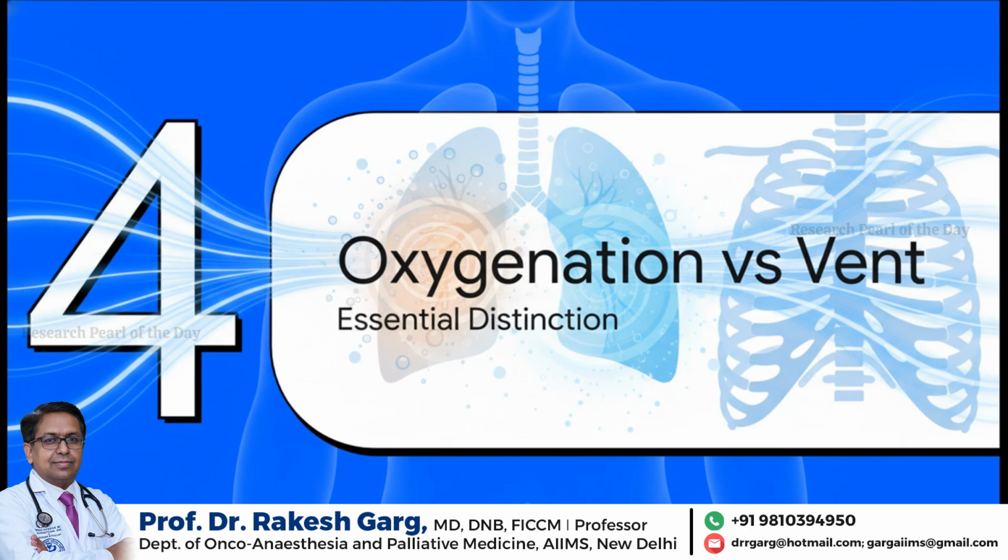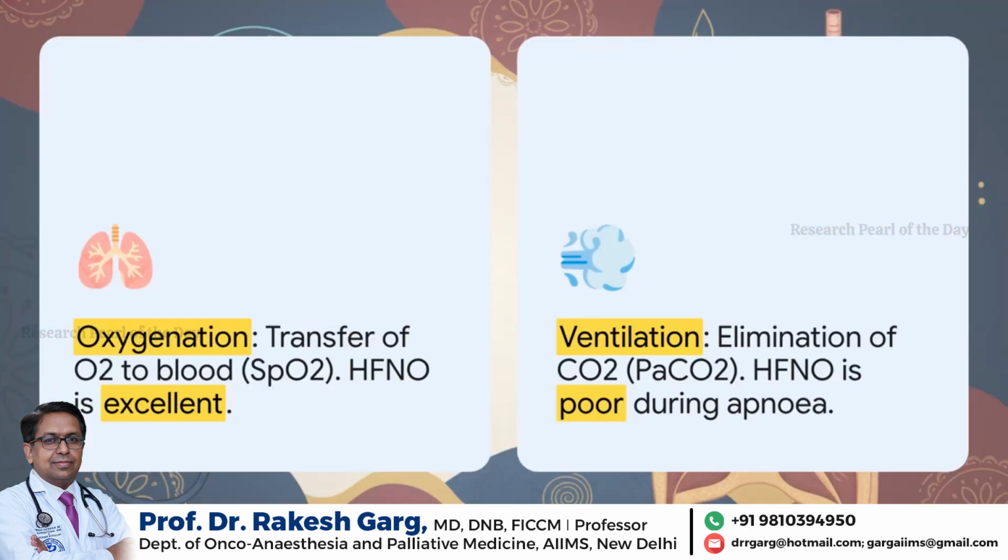You just can't treat HFNO like a mechanical ventilator giving rigid pressure support. Okay, let's get into Section 4, Oxygenation versus Ventilation. If you take only one thing away from this explainer, let it be this. Oxygenation and ventilation are not the same thing, at all. Oxygenation is simply getting oxygen into the blood, which we measure by SpO2. HFNO is phenomenal at this.